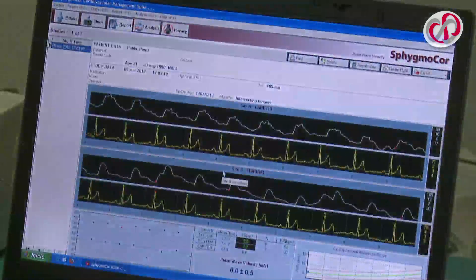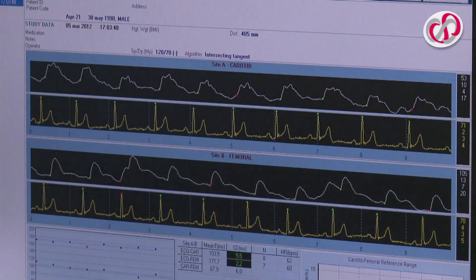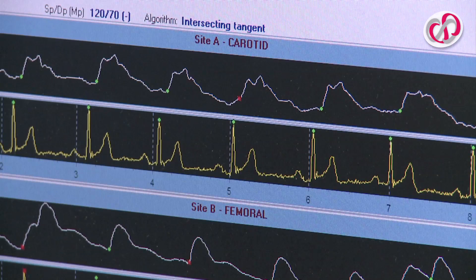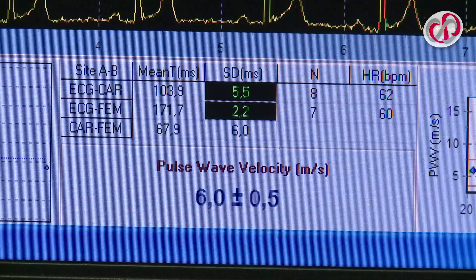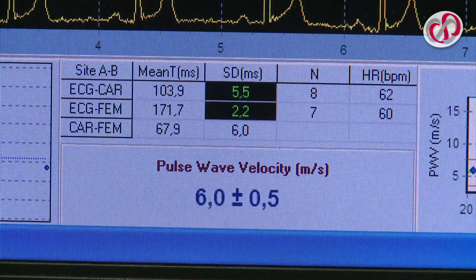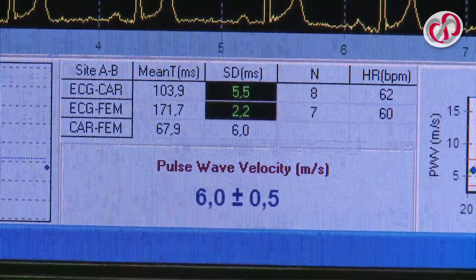Press the space bar and enter the screen with the results of the pulse wave velocity, where we can appreciate with more detail the exact results of the wave velocity, which in this case is 6 metres per second.